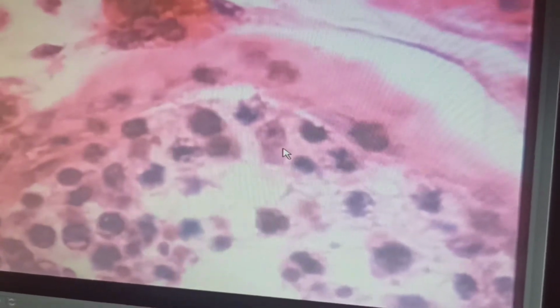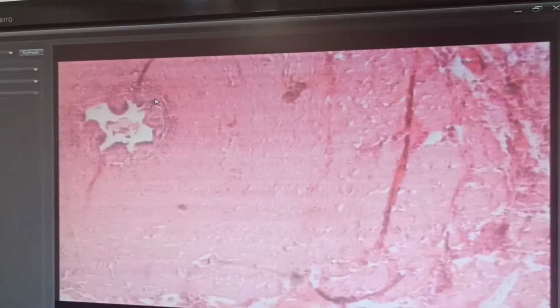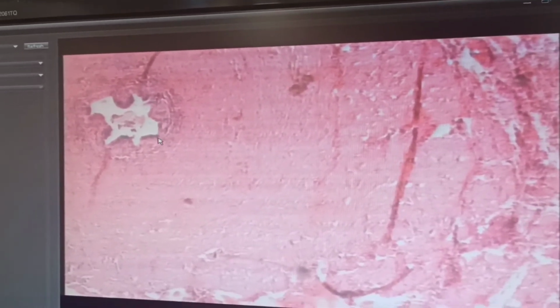Interstitial cells, Sertoli cells. What's the difference from the other structures? Because the vas deferens has a narrow lumen but a very thick wall because of at least 3 layers of smooth muscle cells. Here you can see the epithelium and folding of the mucosa. Mucosa means the epithelium and underlying connective tissue. So we have the folding of that and the epithelium is pseudo-stratified.